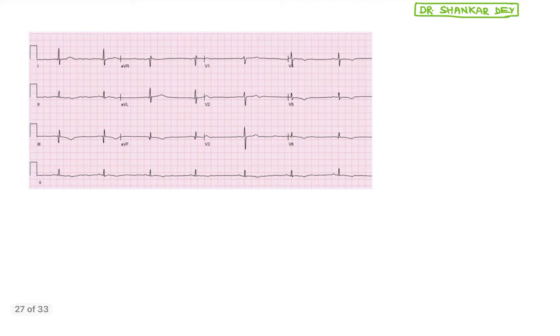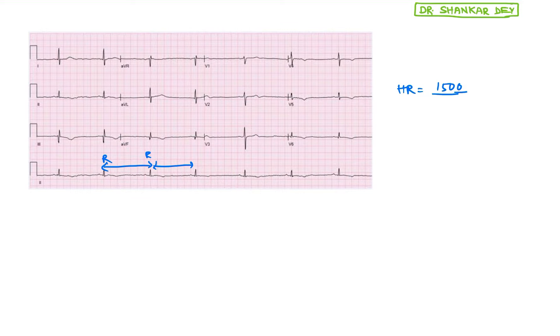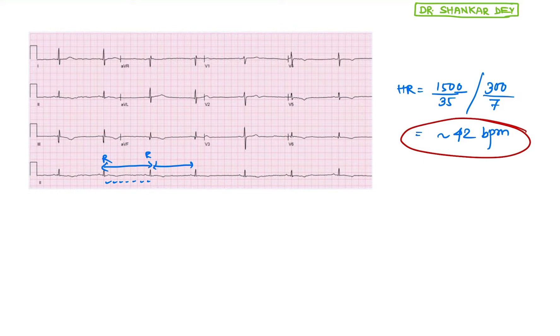Now see the next ECG. In this case, the distance between two R waves is prolonged — very high. So this is an ECG of bradycardia. Calculating the heart rate: 1500 / number of small squares, or 300 / number of large squares. In this case, large squares between two R waves: 1, 2, 3, 4, 5, 6, 7 — so 7 large squares, or 35 small squares. The heart rate is therefore approximately 300 / 7 ≈ 42 beats per minute. Whenever the heart rate is less than 60 beats per minute, that is called bradycardia.